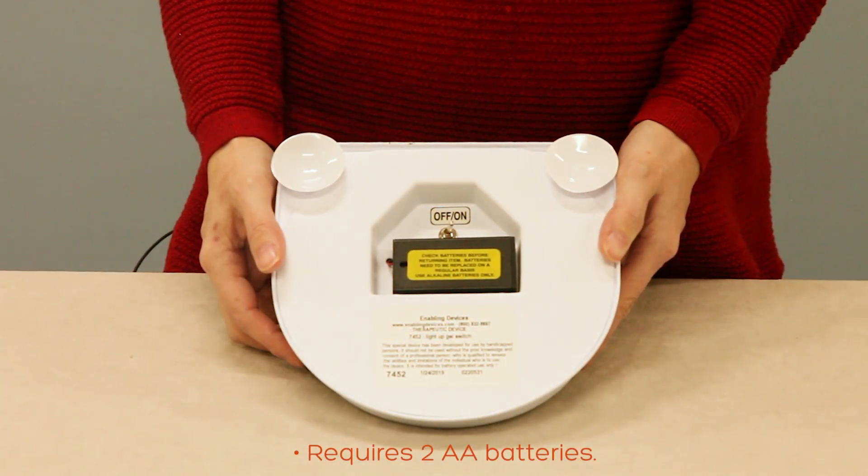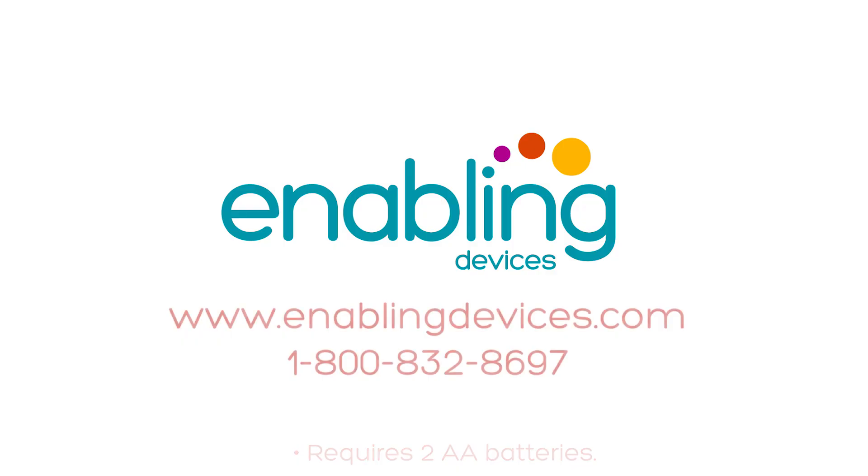This item requires two AA batteries, located at the base of the unit. You can purchase these items on our website at enablingdevices.com, or through phone sales at 1-800-832-8697.